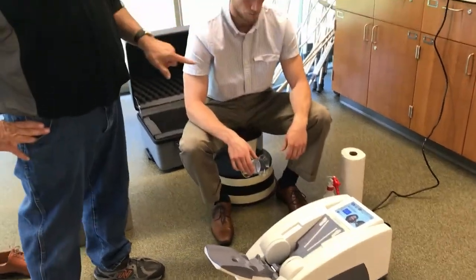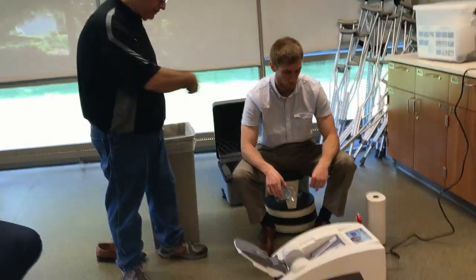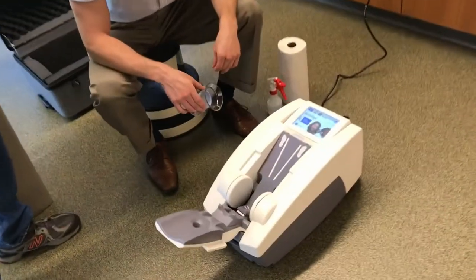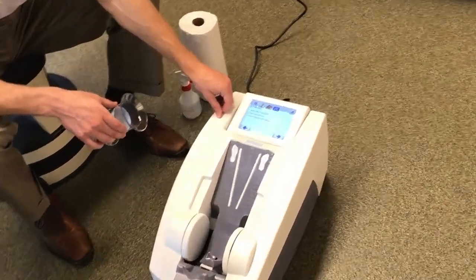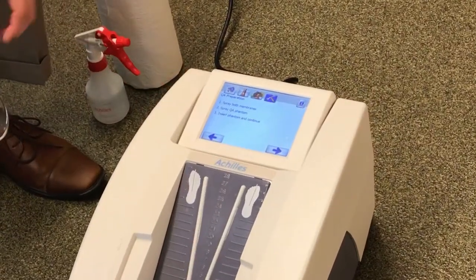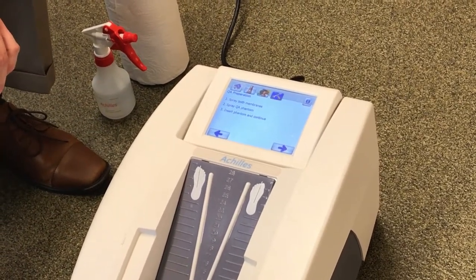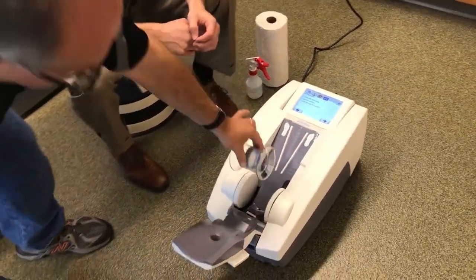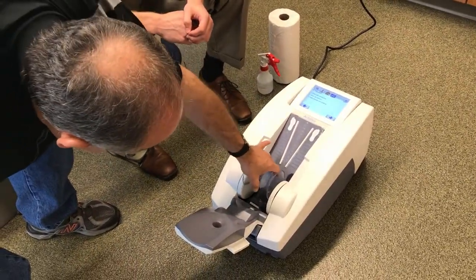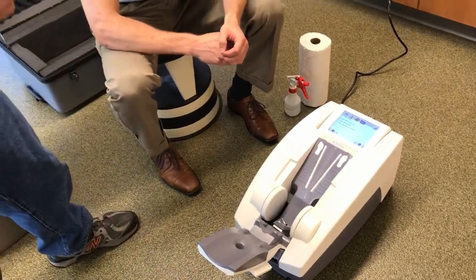Before we do anything, let's come closer and look at the screen. We're going to hit the QA button. Let's read what it says: number one, spray both membranes; spray the QA phantom; and then insert the phantom and continue. Inserting the phantom will be just setting it down like you would with the patient's ankle, right in here between the membranes.